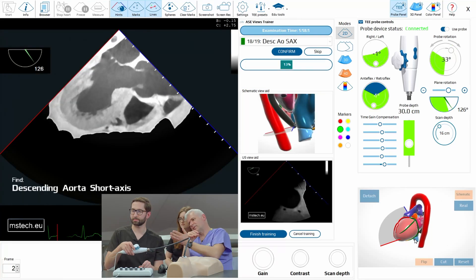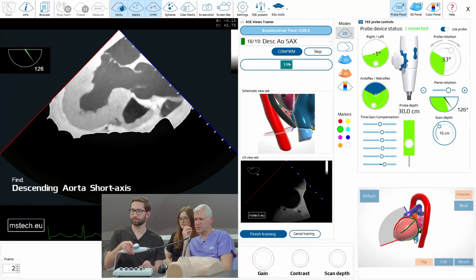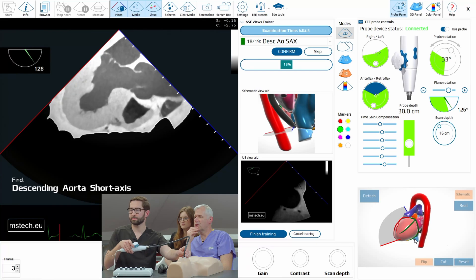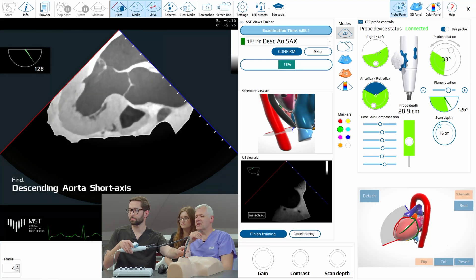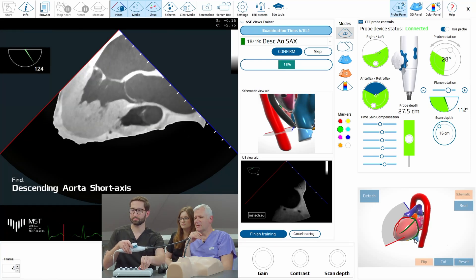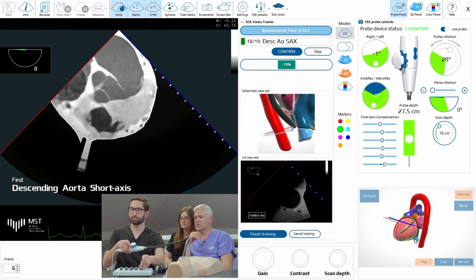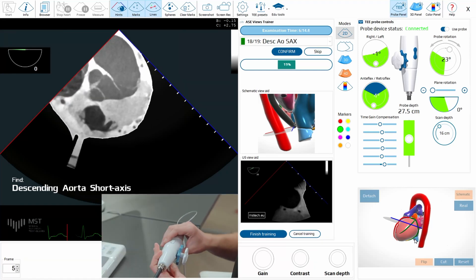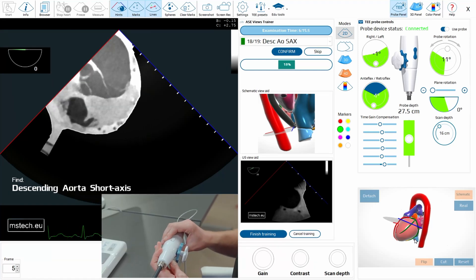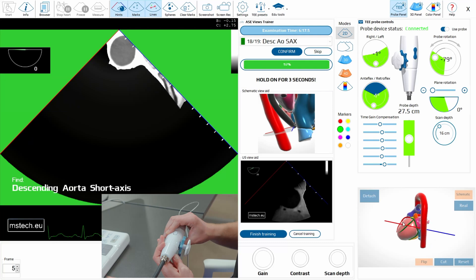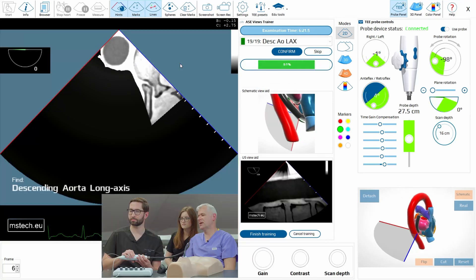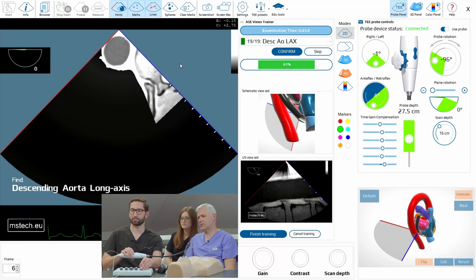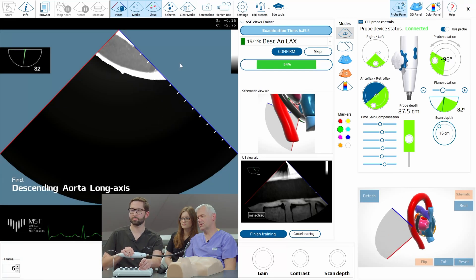The aorta should be more perpendicular here to measure something, but it's okay. Now we did not train the descending aorta, which is the easiest. Go to zero degrees and go to the back. You see here the descending aorta — and now the long axis view of the aorta.